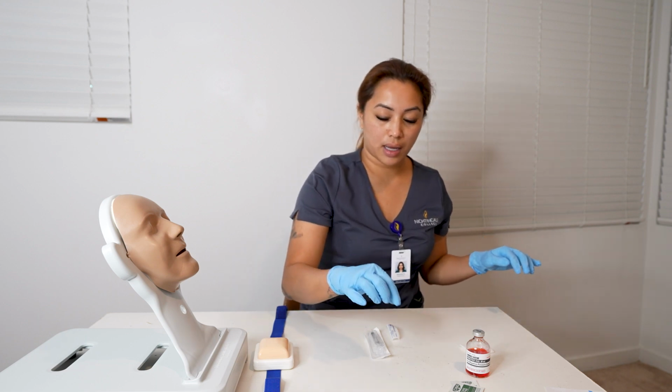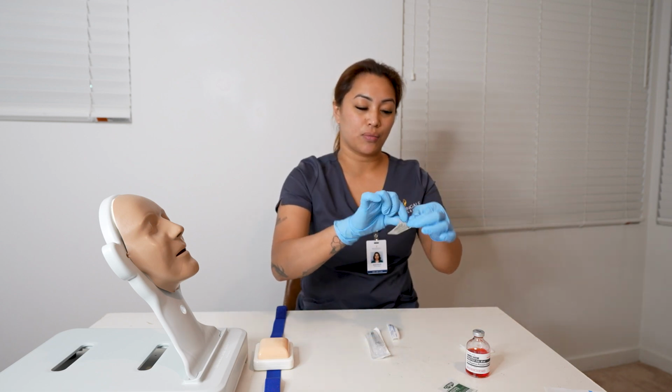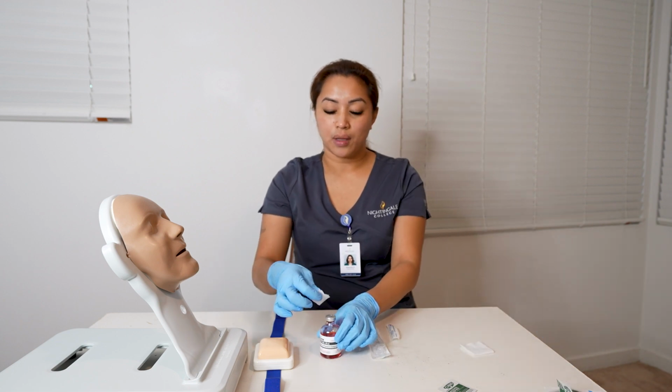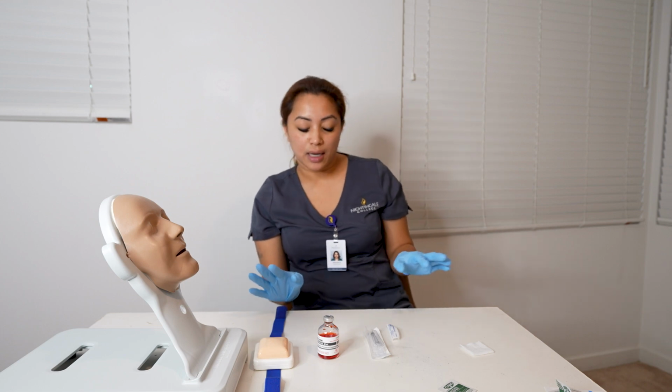So now I am going to get an alcohol pad, open it, get our medication vial. We are going to clean the medication vial from the middle to the outside. All right, throw this away. So now we are letting that air dry.